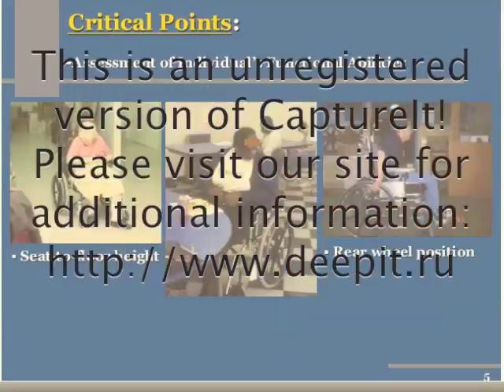Other things that need to be considered for this feature list are things like seat to floor height. The woman in the far left photo uses her feet to propel her wheelchair. Imagine if the frame were too high for her to reach the floor. Could she effectively and independently move her chair? Look at the woman in the center slide. During her evaluation for a new wheelchair, she stated that all that mattered to her was that she could fit at her table to eat her lunch and do her work. Imagine if the frame were too high to allow her to fit under the table. How would that affect her function?